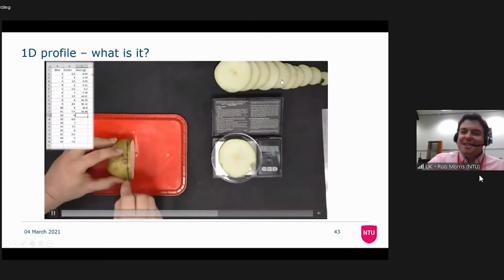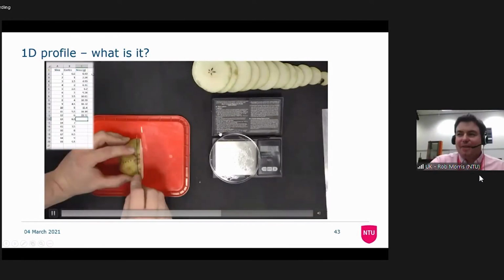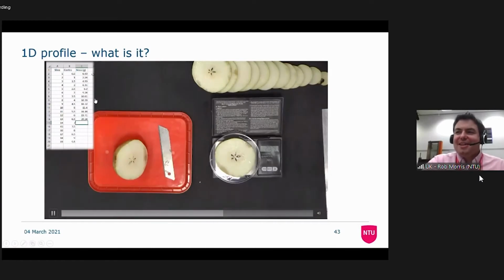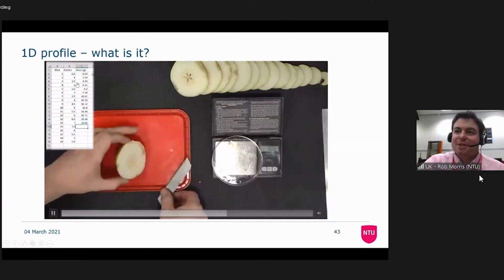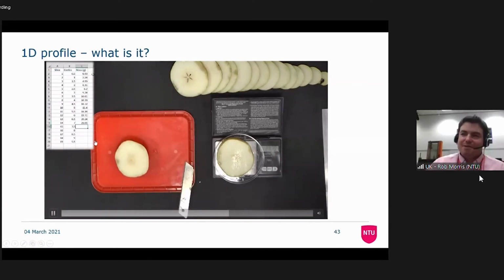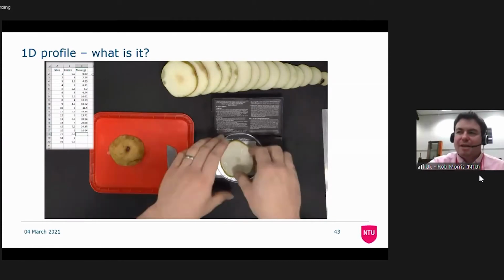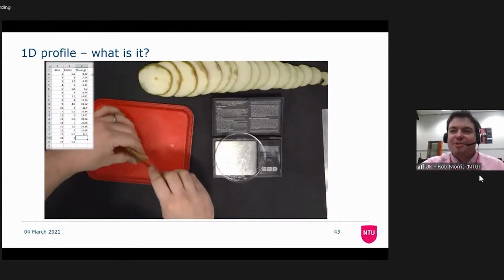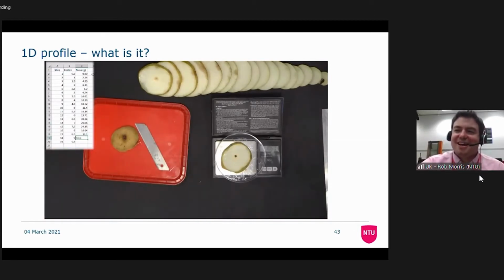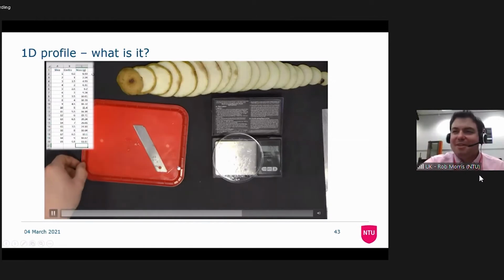Here you can see the pear all sliced up at the top, and we're building up our results. Hopefully none of these are particularly surprising. On the right hand side, where the pear was very thin, we don't have very much mass. Then we build up lots of mass as we come into the big chunky bit of the body, and then all of a sudden it drops back off at the end. You will see a classic spurious result as the last result, because I couldn't actually manage to cut the last slice into 2, so it weighs twice as much as I thought it might, but hey, that's science.